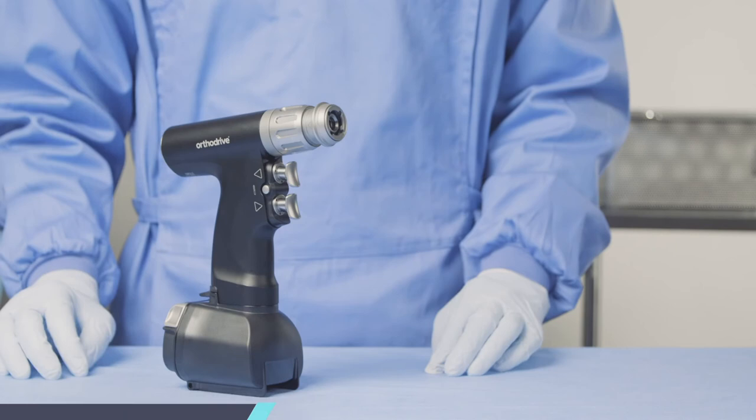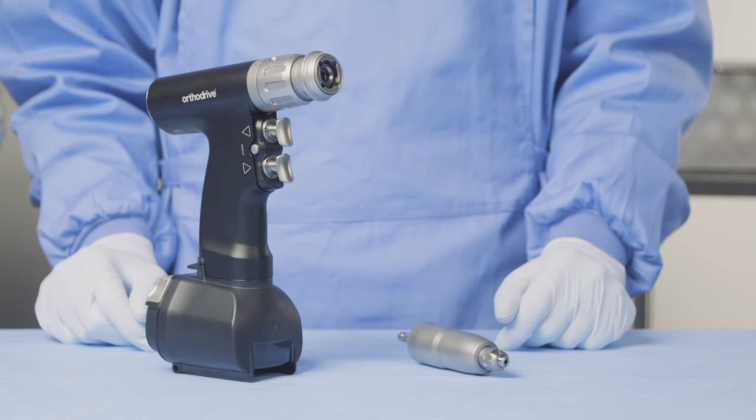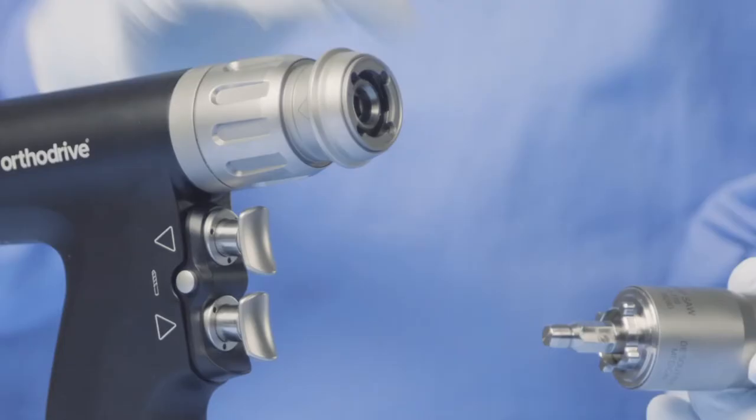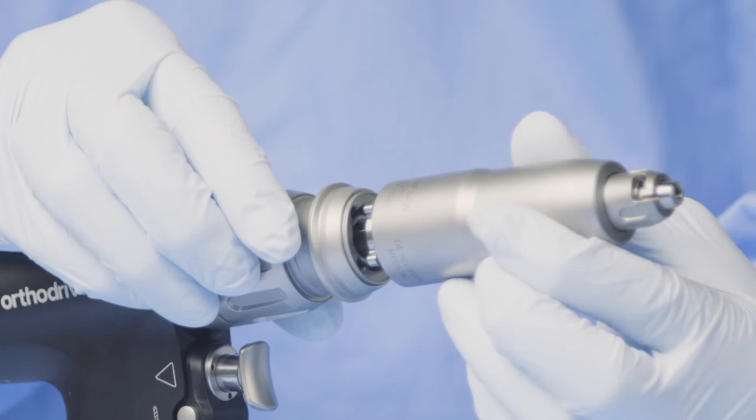If you've opted for a two handpiece system, you will have a CQ710 reciprocating saw attachment that fits into your MBQ handpiece. This attachment is orientation specific, which means you need to line up the prongs with the notches on the tool. To do this, simply take the attachment and turn it 45 degrees anti-clockwise before sliding in. You can then click it clockwise to lock.